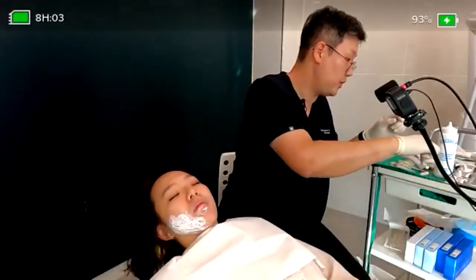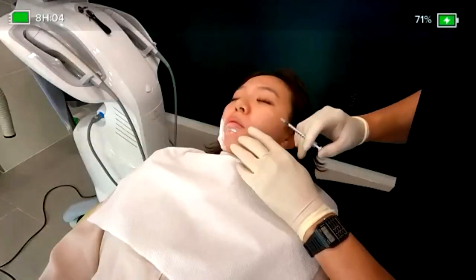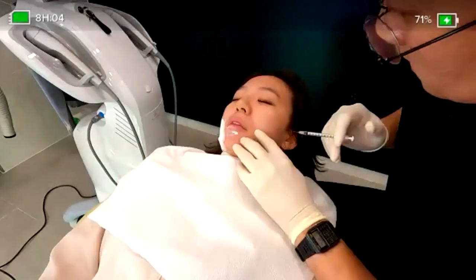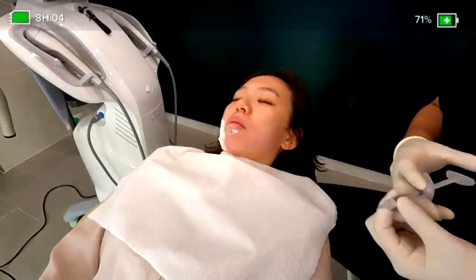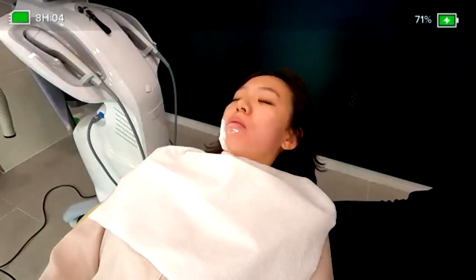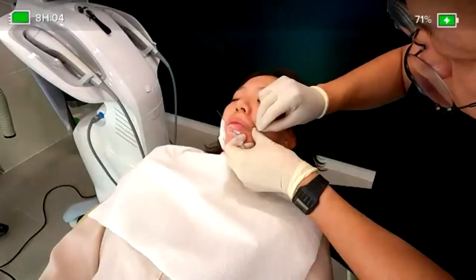So basically, we made a version for this. We make an injection point here, approaching here, then go here.